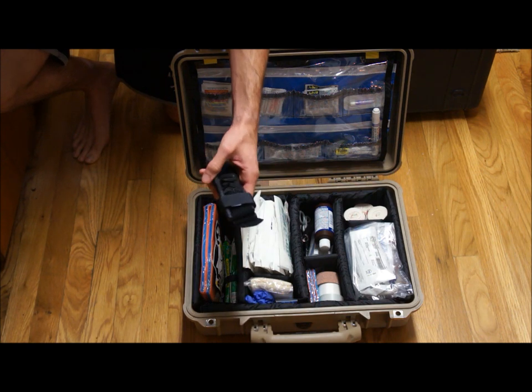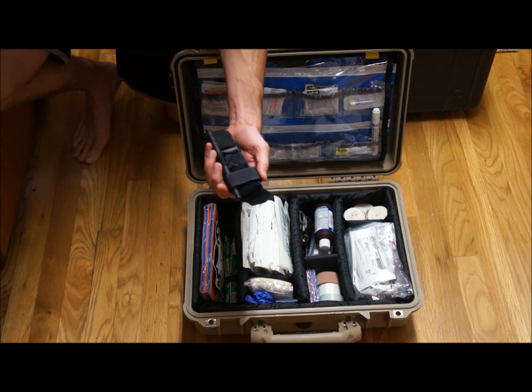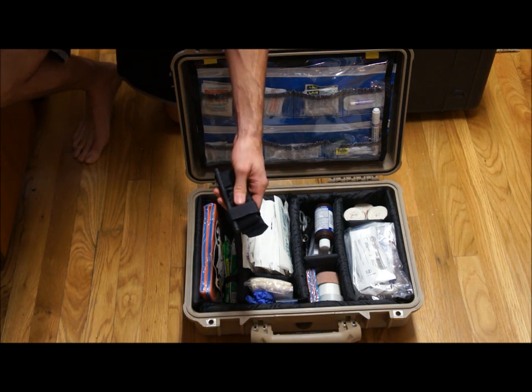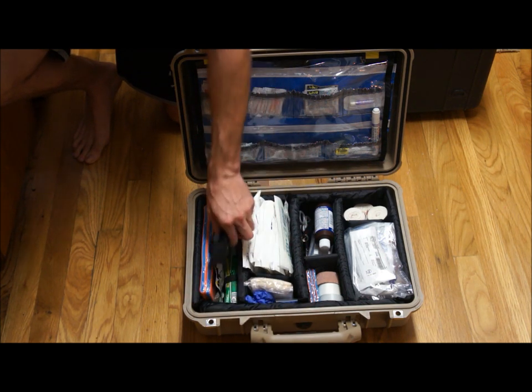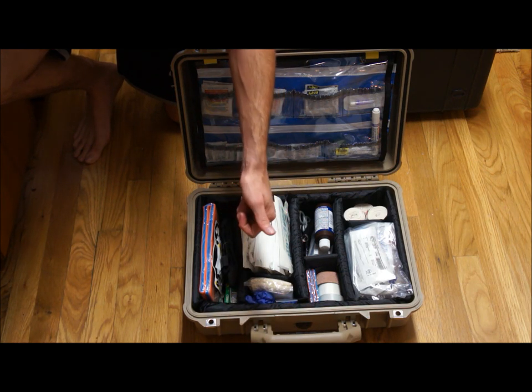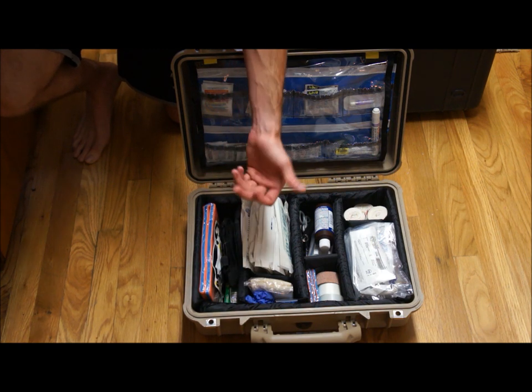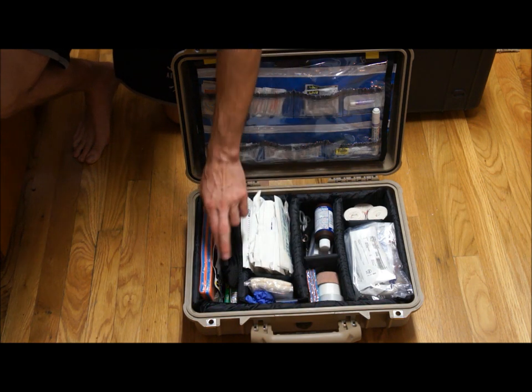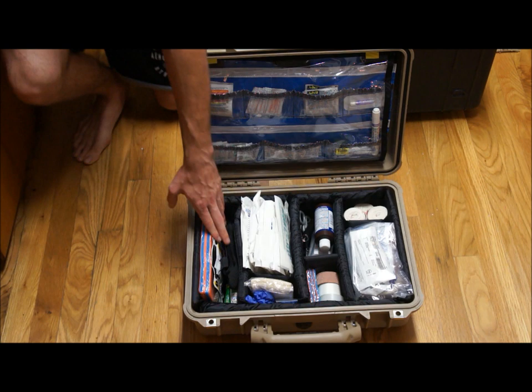This is a CAT — a combat application tourniquet. It would take a lot for me to use this, but I watched one of my buddies take a hard fall the other day. Somebody had cut a small tree down — the trunk was about the size of my thumb, about six inches tall — and it barely missed his leg. If that had punctured his leg and caught his femoral artery, we'd have been screwed. So I keep one of these in here, and I also keep one in my bicycle bag.